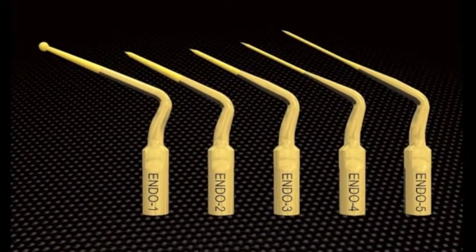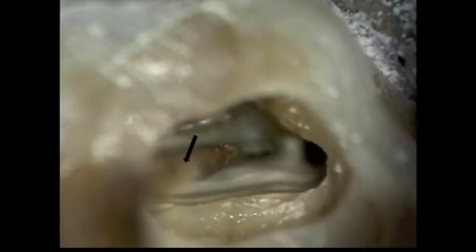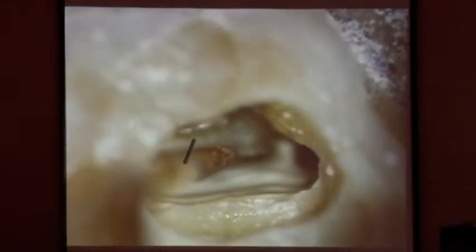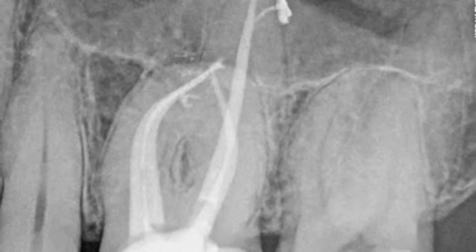The other thing you can use is the ultrasonics, which are also very useful. Here's the ultrasonic — you can activate it and use the dental assistant's air. The dental assistant knows where the air is because she's right there with you. And you can slide this down until — bing — there's the tunnel. And then you treat it. All that effort, and they come together.